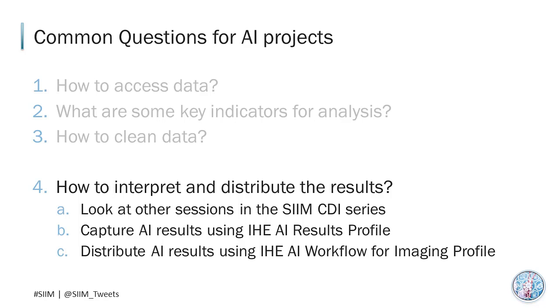Definitely. With this said, IHE, or Integrating the Healthcare Enterprise, publishes some standards-based integration profiles that you may be interested in. To get started, for capturing the AI results, you can take a look at the AI Results profile. For distributing AI results, you can look at the AI Workflow for Imaging profile. For sure. That's actually really cool that IHE has all that profiled.